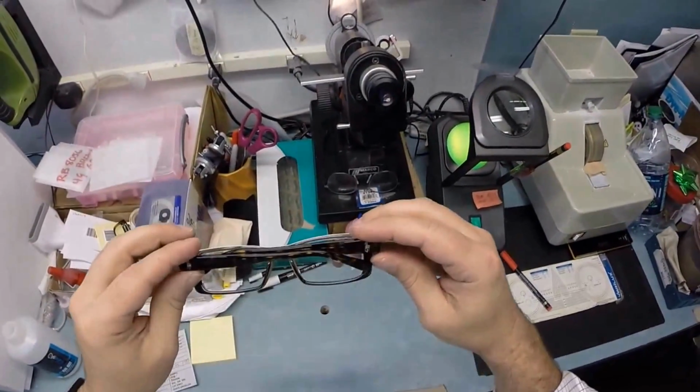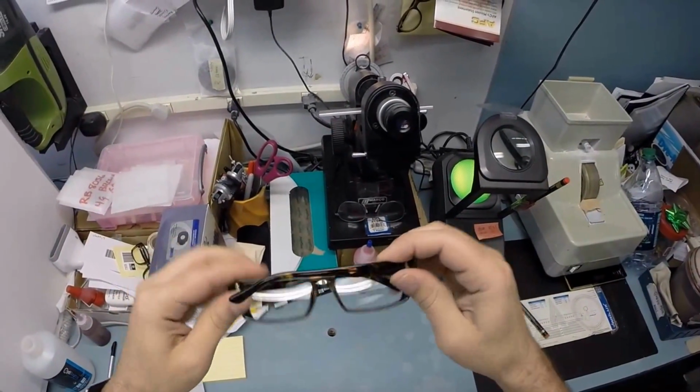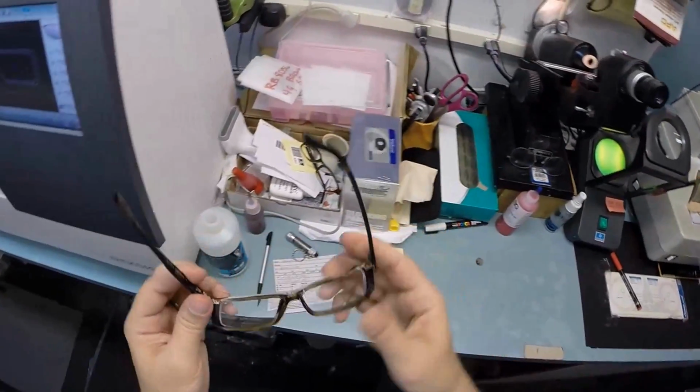I close each temple to make sure they overlap on top of each other perfectly, and they do, and they're not askew or anything like that. I check the tension on each spring hinge, and that is perfect.